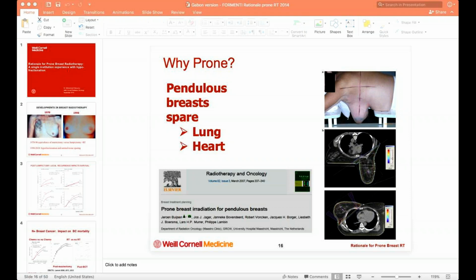That's one of the things we may ask about. If the pacemaker is on the same side, but it seems like it may be out of the field, one thing we do is measure the dose to the pacemaker on the day of the first treatment. You can use a diode or a thermoluminescent dosimeter or MOSFET, just something to try and measure the dose to the pacemaker.